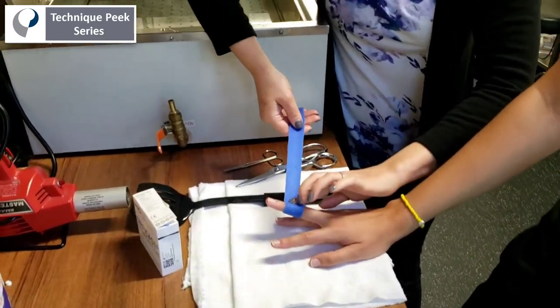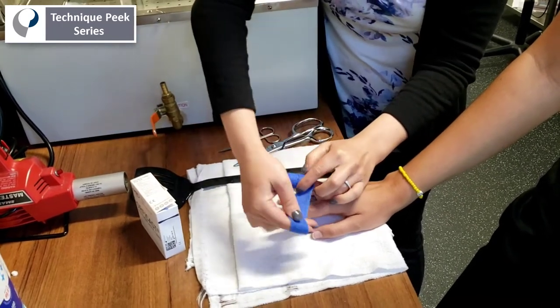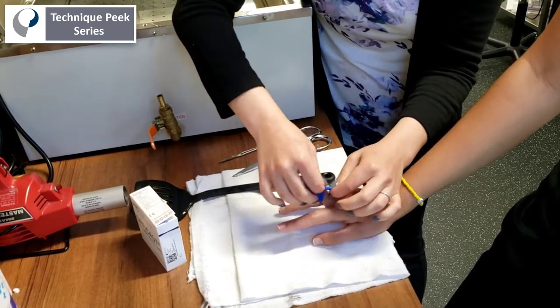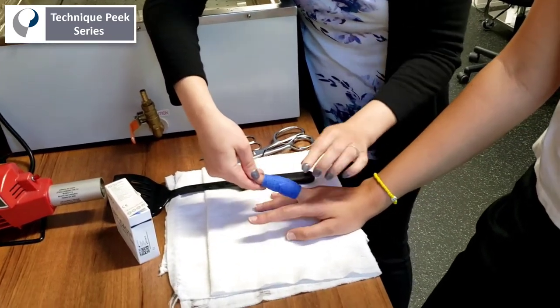Working from the distal end of the finger, just below the DIP joint, going about half the diameter of the strip, and working your way down like you're wrapping an ace bandage. Not pulling too tightly — we don't want to cut off circulation. And the great thing is when you get to the end, you just smooth the edge into itself and it's a nice smooth cast.